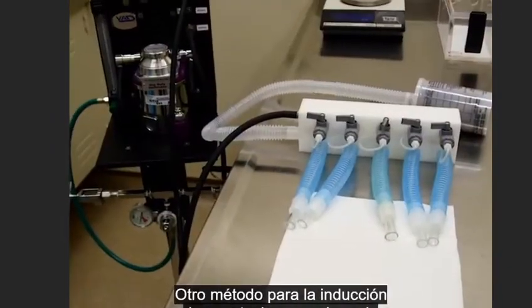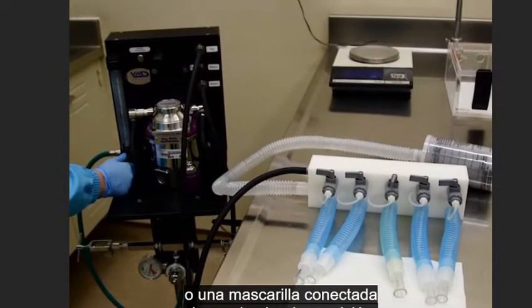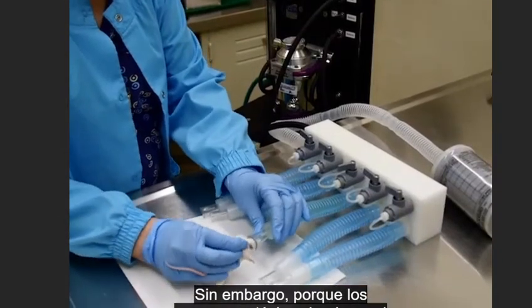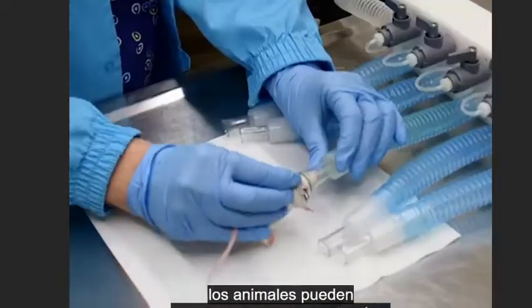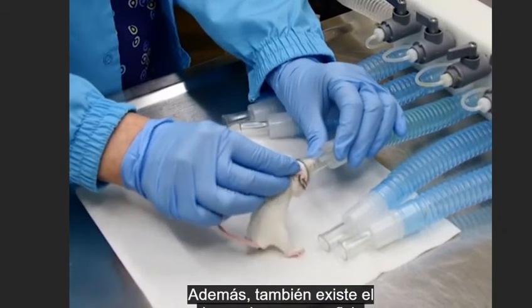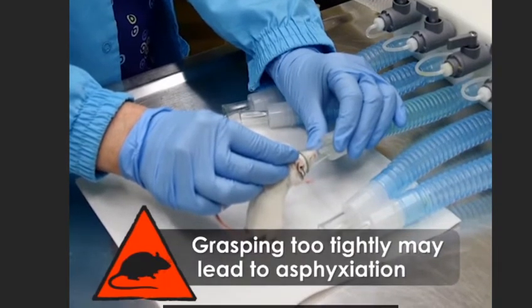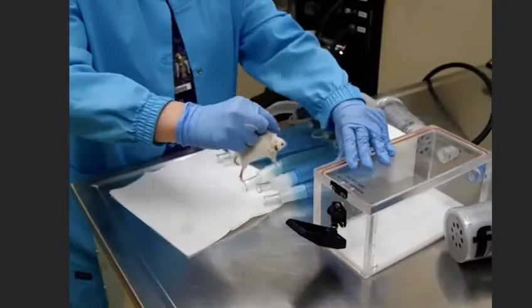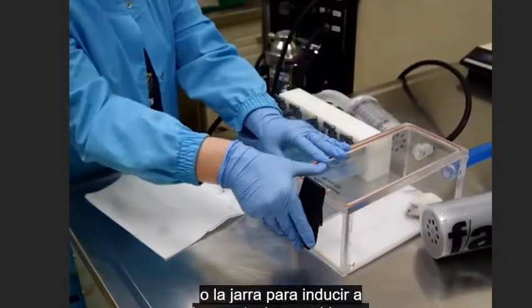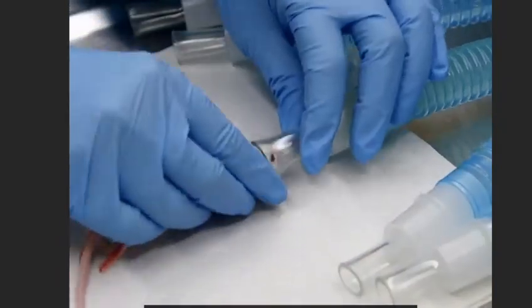Another method for anesthesia induction is via nose cone or face mask, also connected to the precision vaporizer. However, because anesthetic gases have an unpleasant smell, animals may object to being masked for induction. In addition, there is a risk of causing asphyxiation because of grasping too firmly. Therefore, the preferred method is to use the induction box or the bell jar to induce anesthesia, followed by maintenance with the nose cone.